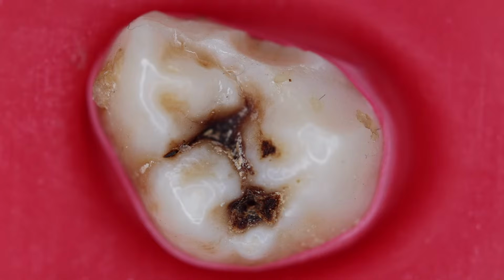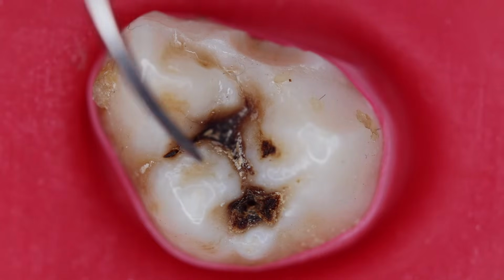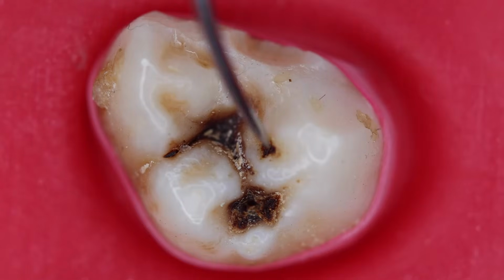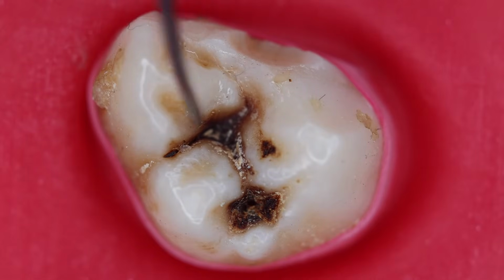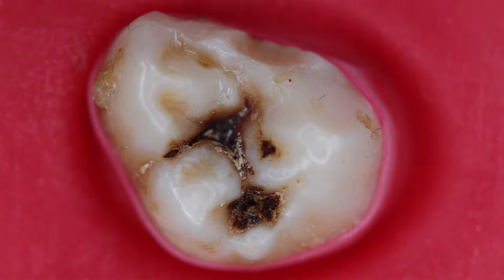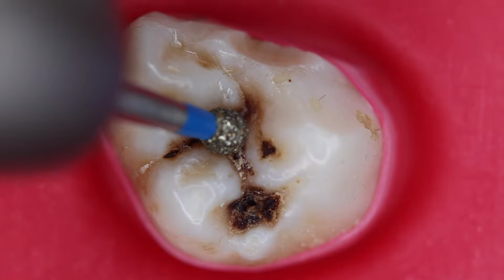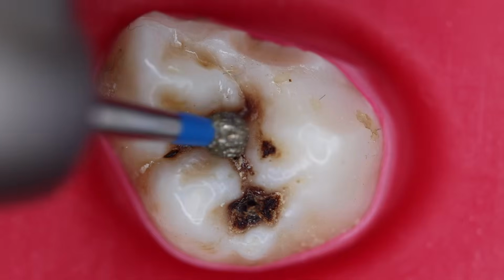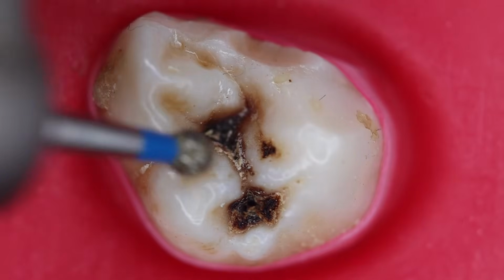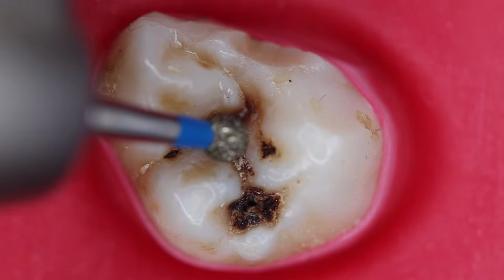Initially, when we start to plan the access cavity preparation, we will remove the caries that is there. The occlusal aspect, which is covered by the caries, would be removed, and then we would have a central approach. We won't approach from the distal aspect or the mesial aspect, but keep the central approach with the big round diamond point, and go slowly, removing the caries. So let us begin the preparation.